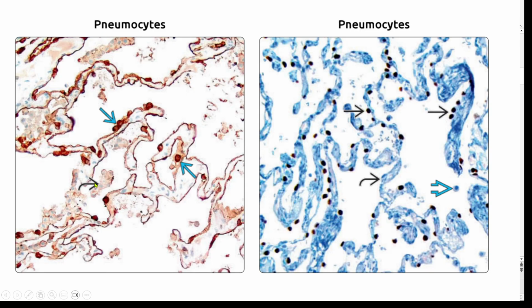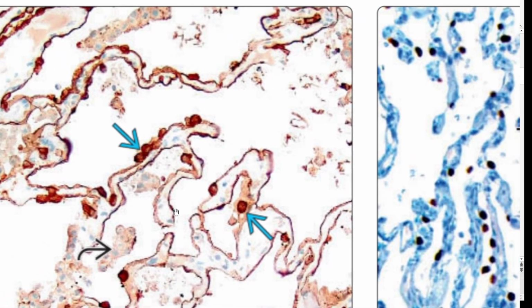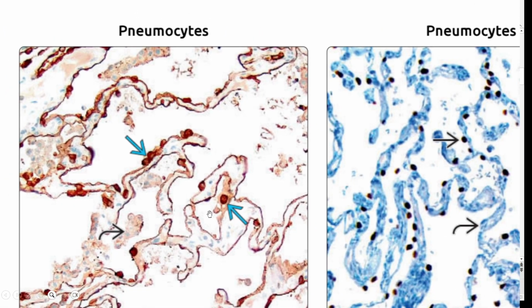So pneumocytes, what do we have here? This is cytokeratin. This is a pan-cytokeratin stain, and this delineates the epithelial cells. Basically, in here, it shows the pneumocytes, which have this cytoplasm, very thinly giving those shapes around to give these spaces more surface area.